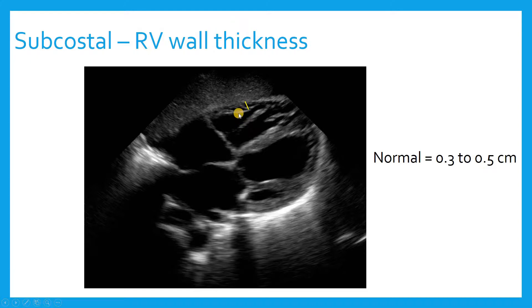The subcostal view can be used to measure right ventricular wall thickness. This is most helpful for understanding the chronicity of right ventricular failure. So if somebody has a thin right ventricle — which normally measures 0.3 to 0.5 centimeters — and they have very significant evidence of pulmonary hypertension, then you are dealing with an acute cor pulmonale syndrome and not a chronic disorder.